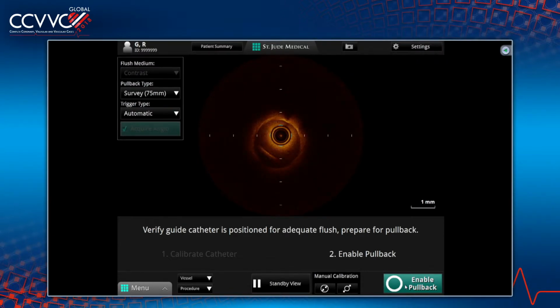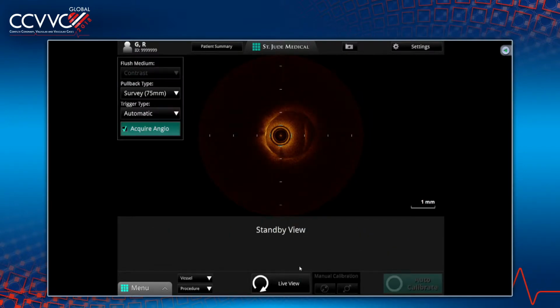LAD, and just to tell you that we did do an app about this imaging modality, and it is available free. We are going to release it today. Everybody can go and check on the App Store, called Octade. They're going to show it on the side so you can download this. A team of physicians from here, Mount Sinai, along with Mount Sinai App Lab did it, and it was coded from India by Viba Technologies. Please download it, and you can then go step by step on how to do OCT.